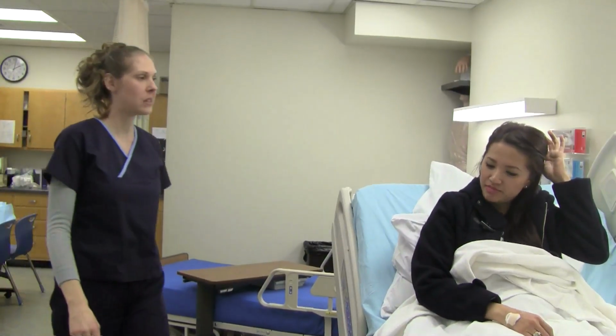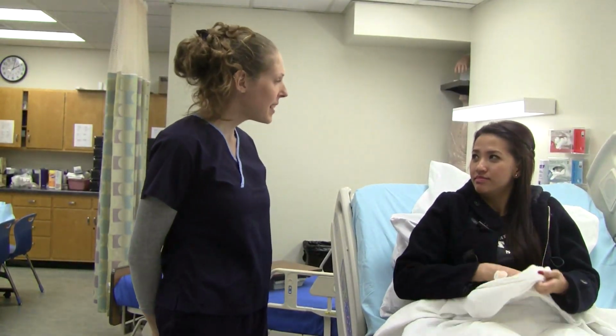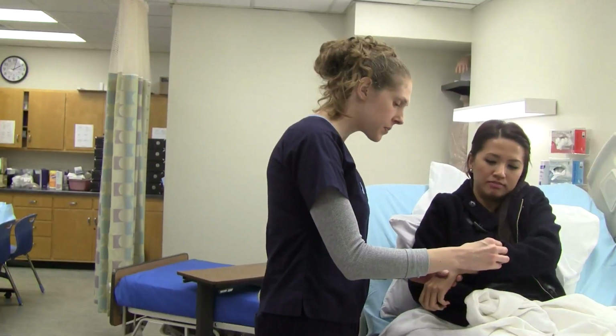Introduce yourself and verify the patient's identity. My name is Carla. I'm going to be your nurse today. Can you tell me your name? Lin Chao. Great. And your date of birth? January 6, 1983. All right, great.